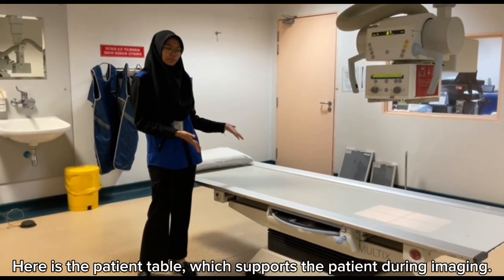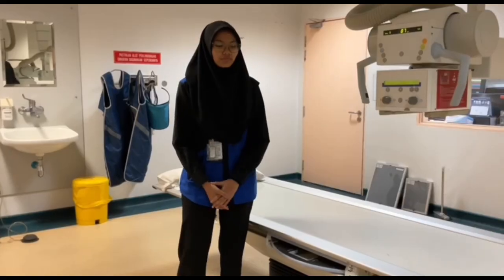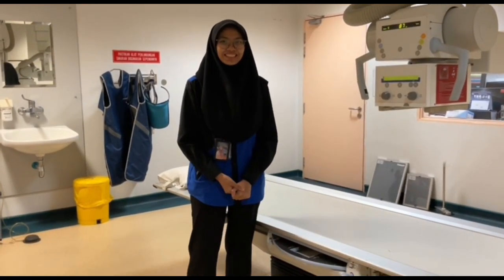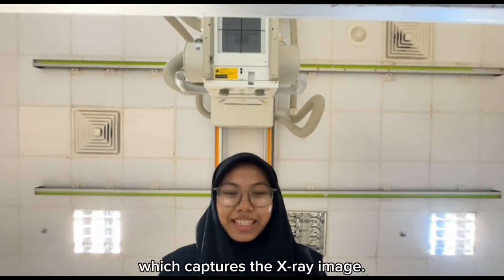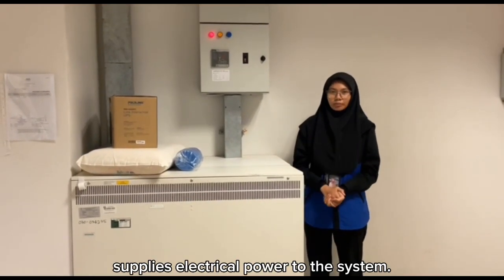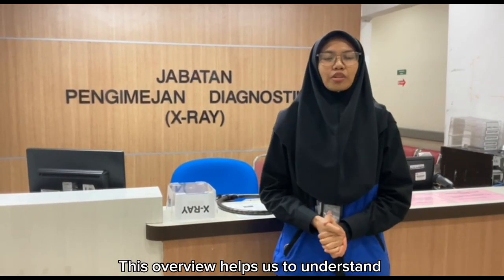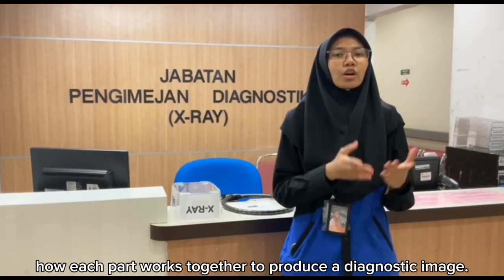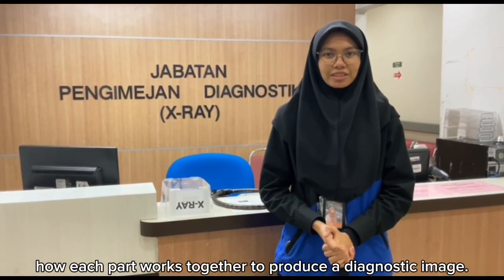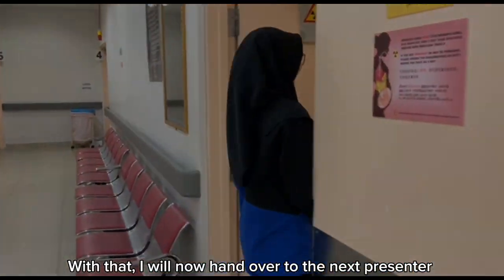Here is the patient table, which supports the patient during the imaging. Below or behind the table is the bucky or image detector, which captures the X-ray image. Finally, the generator, which supplies electrical power to the system. This overview helps us to understand how each part works together to produce a diagnostic image. With that, now I will hand over to the next presenter.